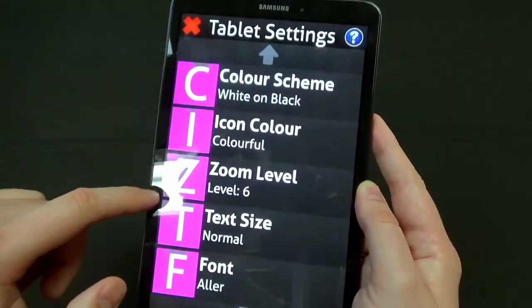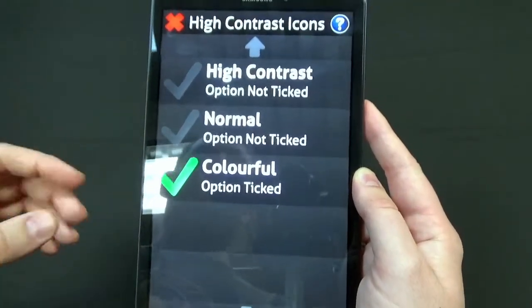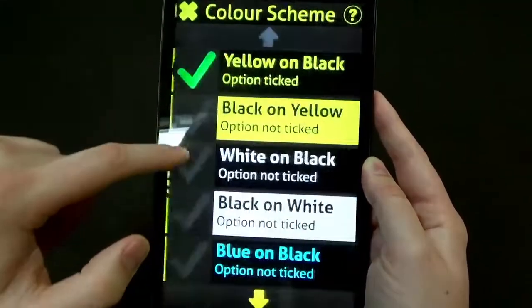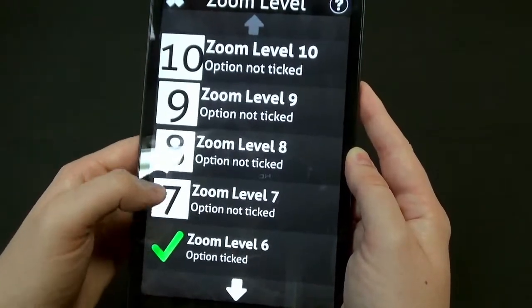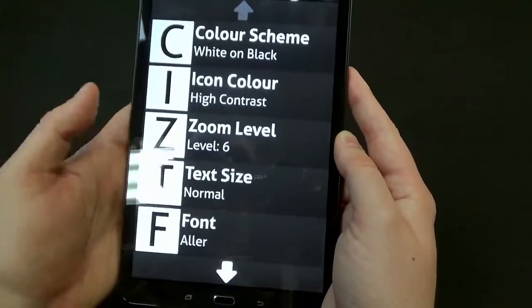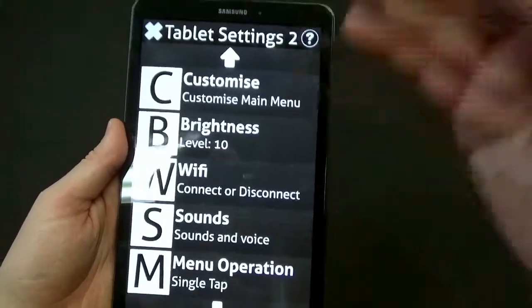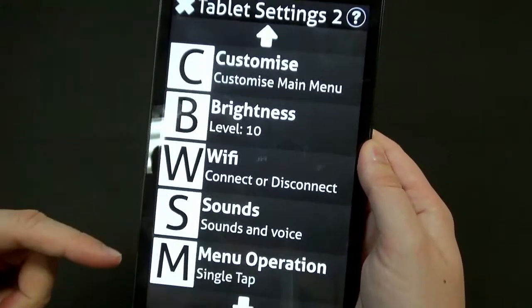There we go — it changed all our text to white on black. We can also change our icon color — colorful icons, normal, or high contrast icons which mimic your high contrast mode. We can also adjust the zoom level to make anything on the interface larger or smaller. Right now I'm on zoom level six; let's try zoom level eight — everything is much larger now. We can change text size, font, and customize our menu layout so that frequently used options like voice control appear at the top. You can also change brightness and connect to wifi.